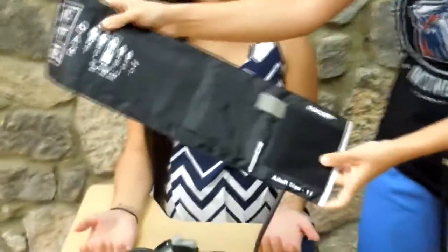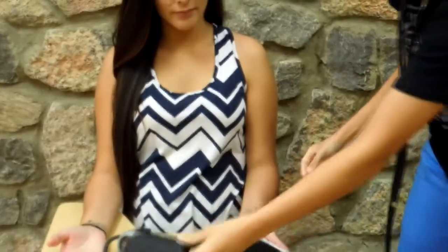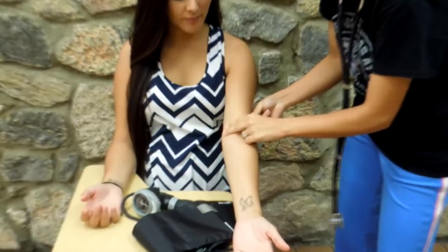There are markers inside the bladder that demonstrate both size and proper alignment. Palpate the area to find the brachial artery pulse. Ensure that no garment obstructs the area.